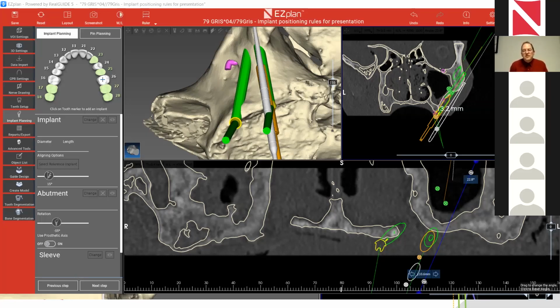Of course, the Zygomatic enables you to position the implant in the correct position, in the correct orientation, and to have the multi-unit angle exactly the way you want it so that you can take the restoration and put it directly on. That's the accuracy of the Zygomatic, if it's performed.